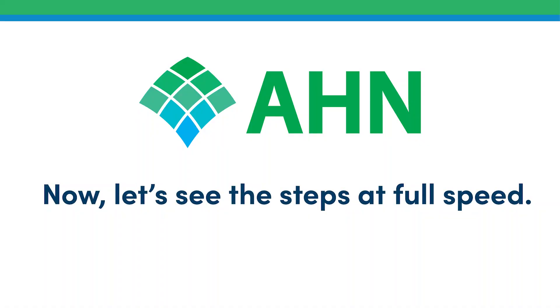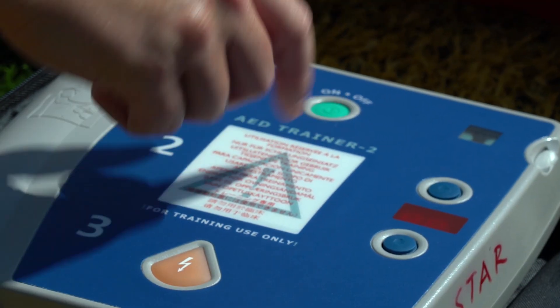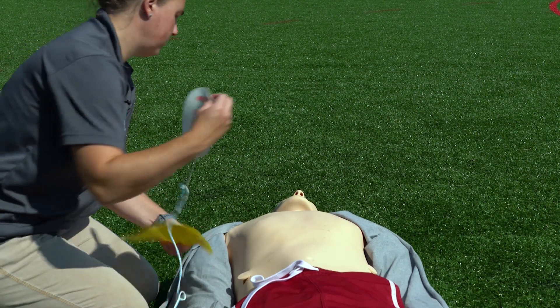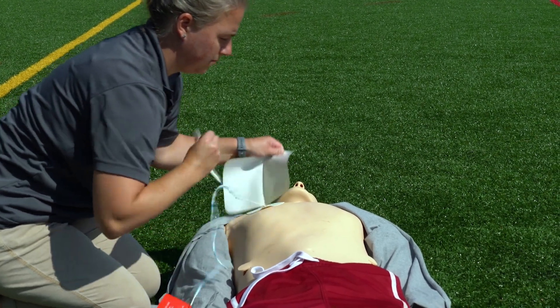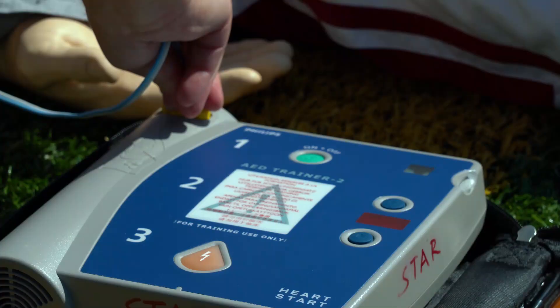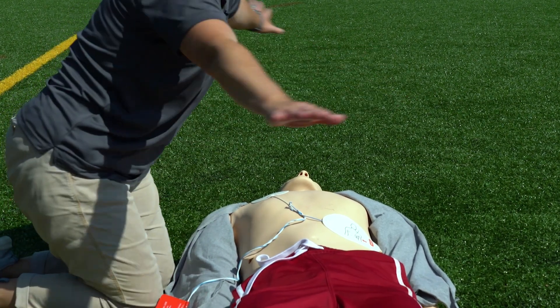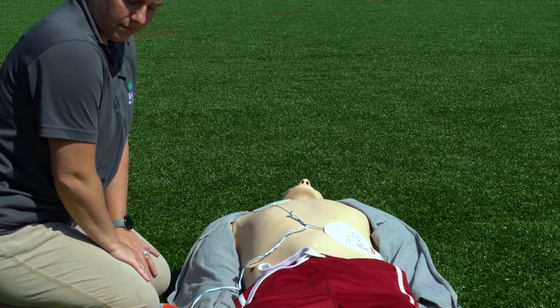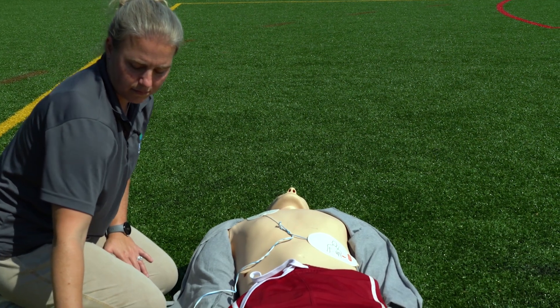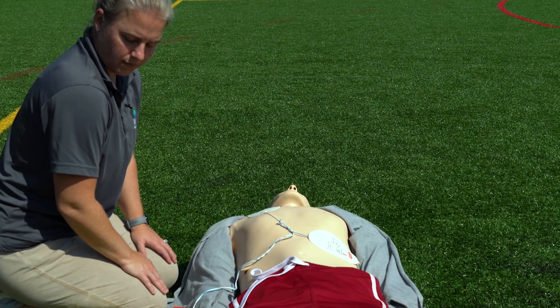Now let's see the steps at full speed. Apply pads to the patient's bare chest. Plug in the pads connector next to the flashing light. The AED announces: 'Analyzing. Stay clear. Do not touch the patient. Shock advised. Charging. Stay clear of patient. Everybody clear! Deliver shock now.' Press the shock button. Begin CPR.